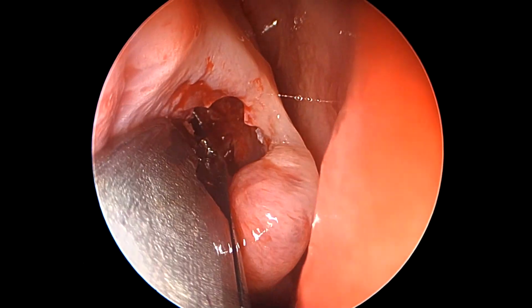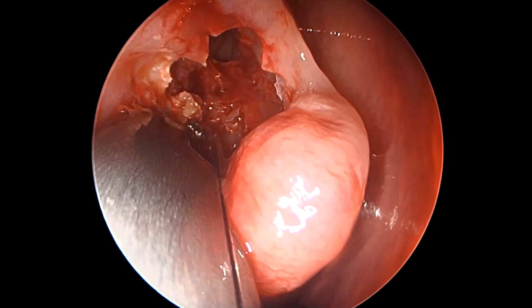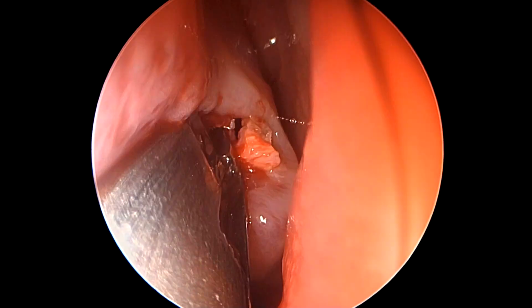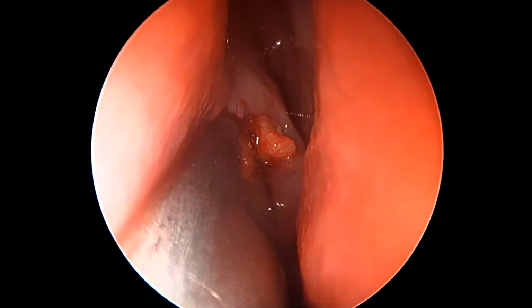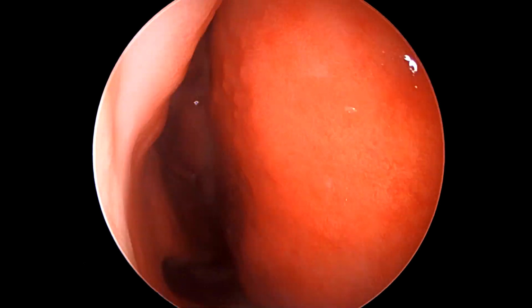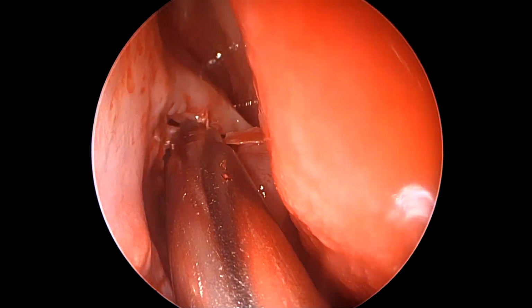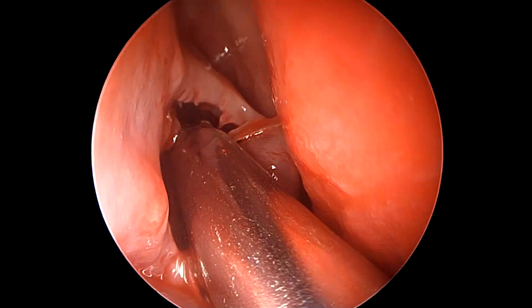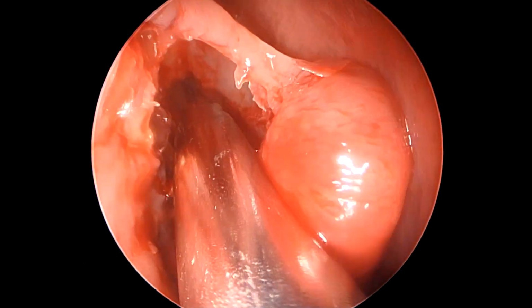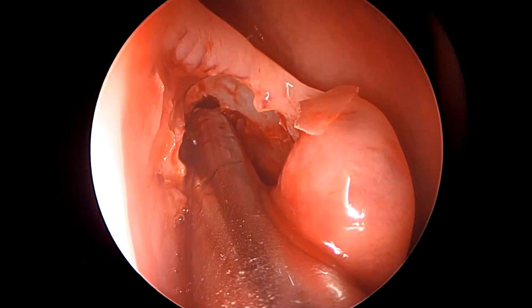So what we do here is to increase our access anteriorly, without which we cannot go posteriorly. So we take a straight bone punch. Sometimes we can even take a slightly curved DCR punch and remove some bit of bone of the anterior agger wall flush with the orbit to be able to again increase our vision inside the frontal recess. The only thing one has to mind in these patients is not to fracture or break the axilla, because then that would lead to a floppy middle turbinate, which would eventually lateralize and lead to late cicatrization or stenosis of the frontal recess.